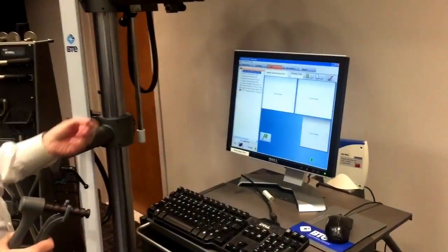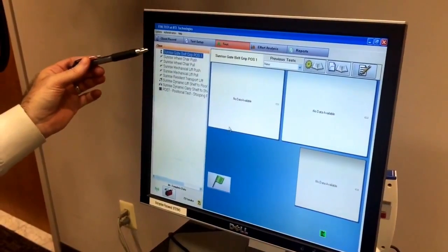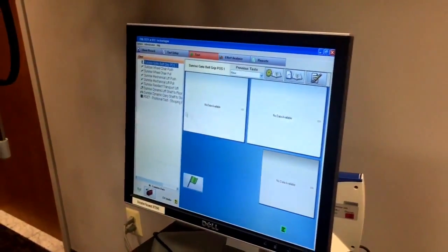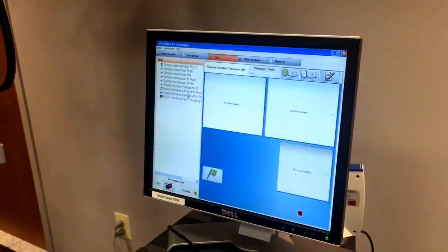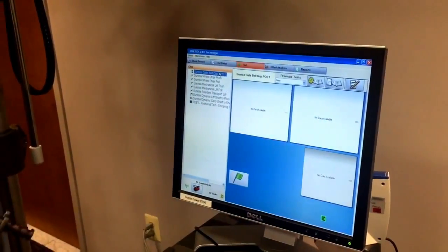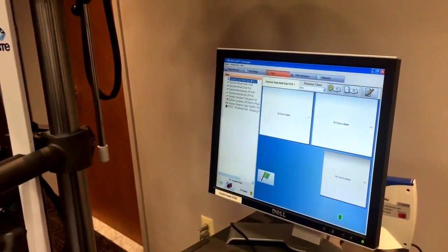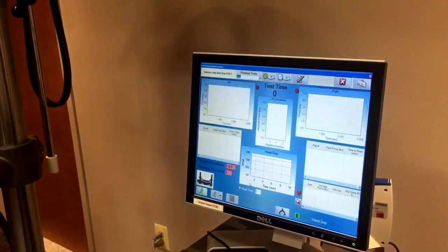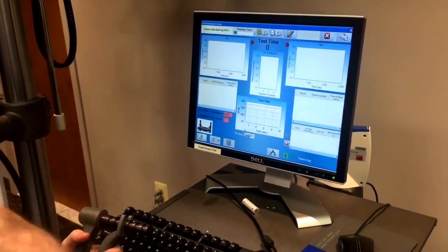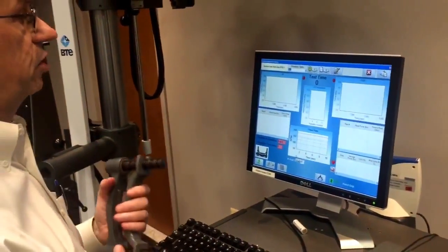In the software, I've pulled up a template — because you can create templates, you can use functional capacity templates. This person has multiple different tests that we want to do, and it will walk them through that protocol one by one. You'll see some differences in the appearance of the screen as we pull up different tests. When you're ready to begin, make sure the transmitter is turned on, then click on the green flag — it brings up the test screen. You'll notice that heart rate is being monitored. The subject will have a heart rate monitor on, so if the heart rate gets elevated to an unsafe level during the test, it will stop the test automatically.